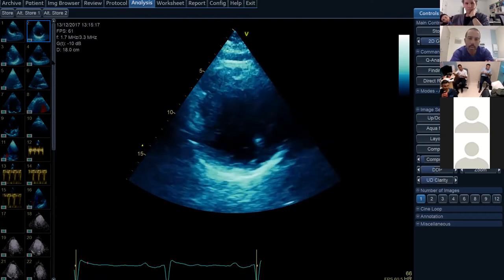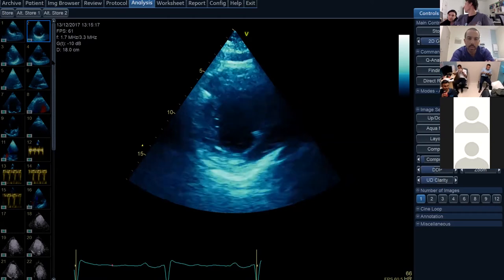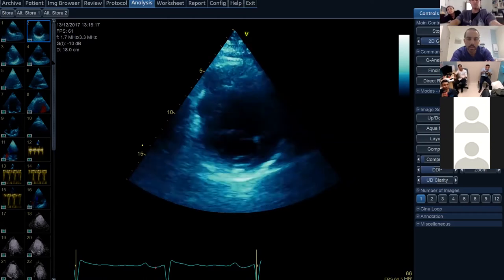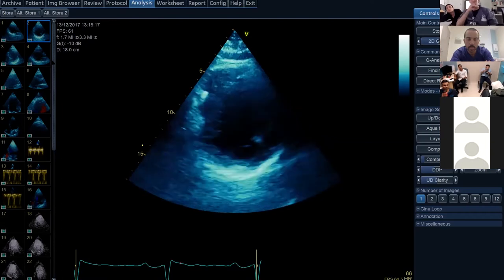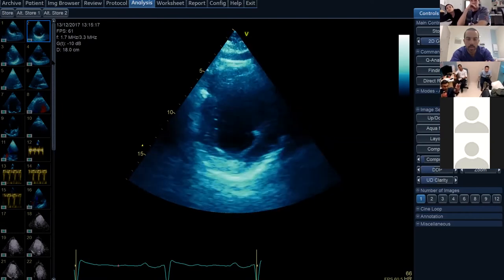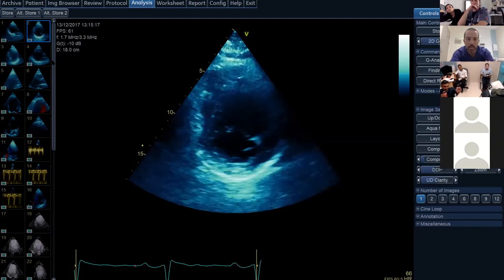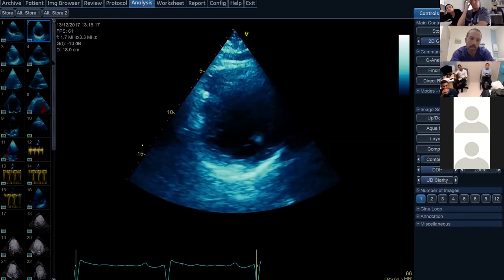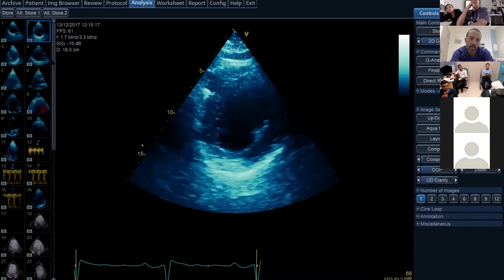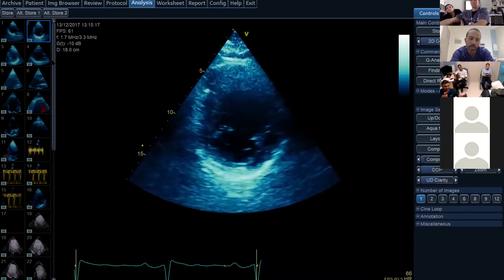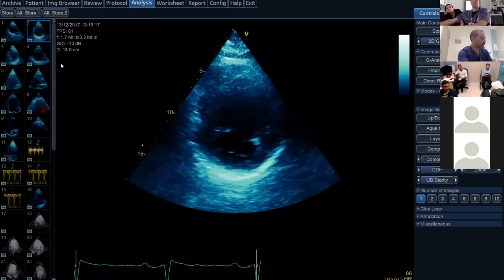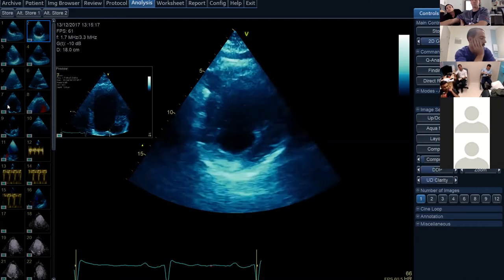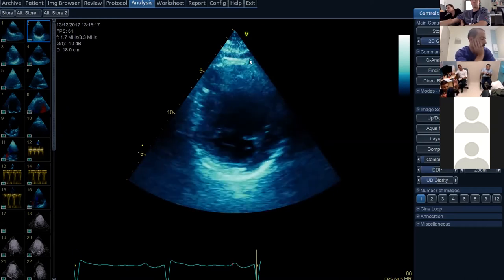This is a short axis view at the level of the mitral valve. Looking to confirm the regionality seen on the previous images. The anterolateral wall is not well visualized but is probably down. All regions appear hypokinetic, with the inferior and inferoseptal regions perhaps less affected than the others.